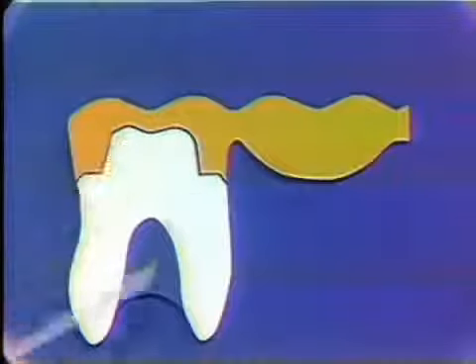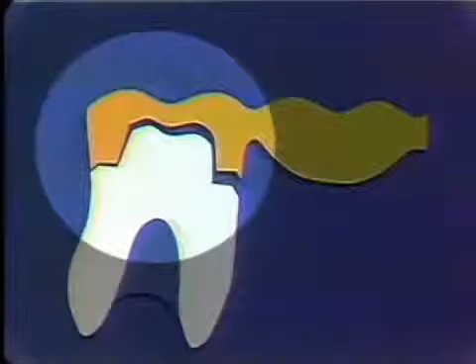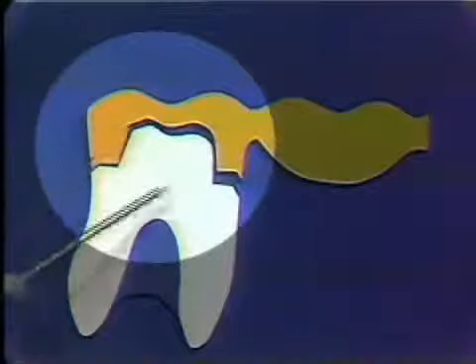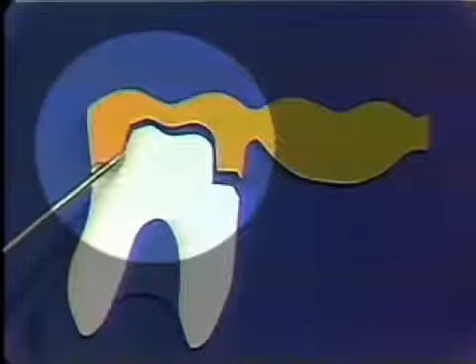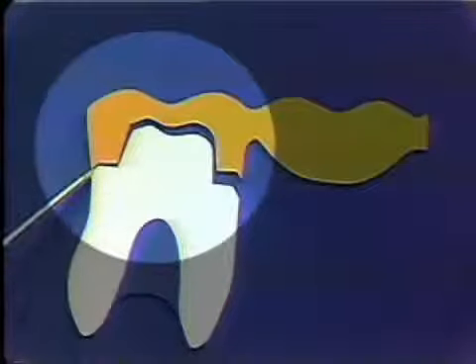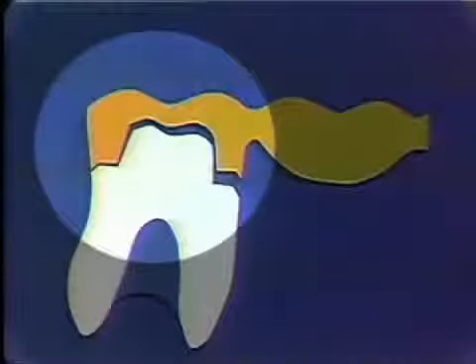I think if we can just do that movement over again, you will see, if you look at the cement lute around here, that it is being subjected mainly to tensile and shear forces. And because cement has a very poor tensile and shear strength, it will not stand up to this type of stress for long. It will fragment and break. And so this retainer will come loose on this particular preparation. So you see here a situation where a short clinical crown with tapered proximal surfaces on the distal and the mesial, such that it allows the mechanical rotation of the tooth out of the retainer will result in the failure of this particular bridge retainer on a point of retention.